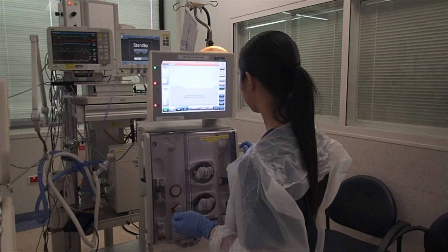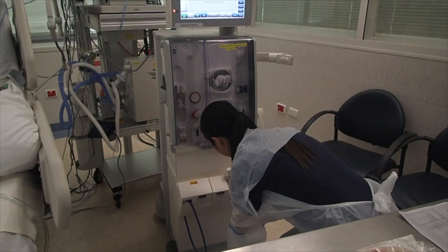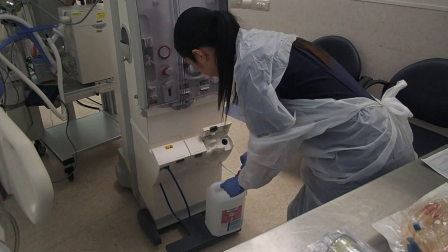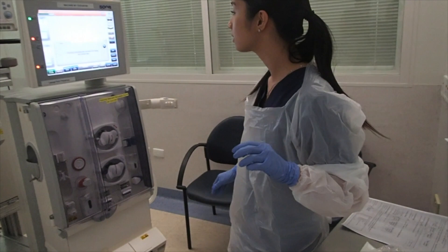Firstly, you need to start the treatment, which will automatically start the T1 test. Then you need to connect the acid canister to the Part A solution. Make sure you close the lid afterwards.